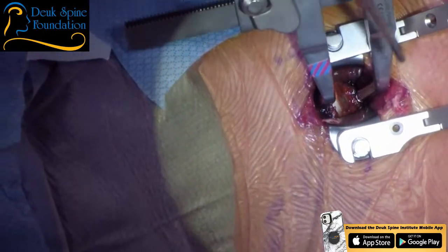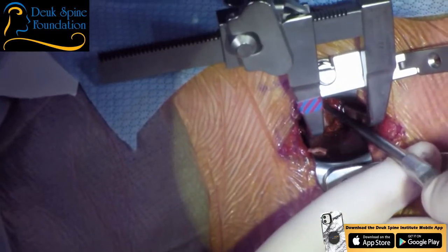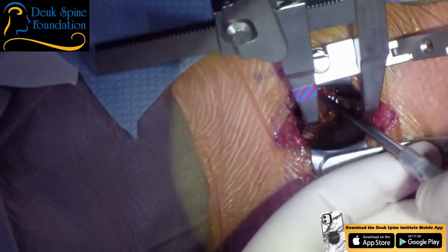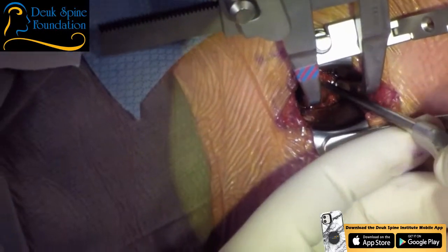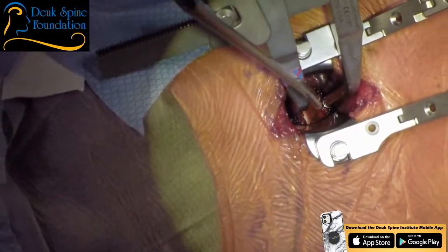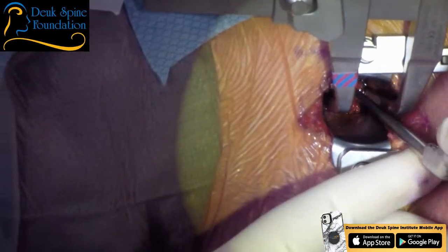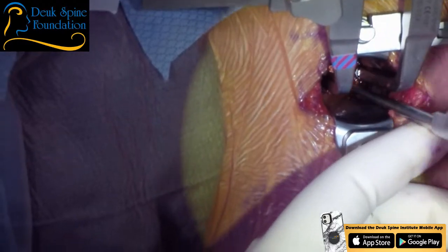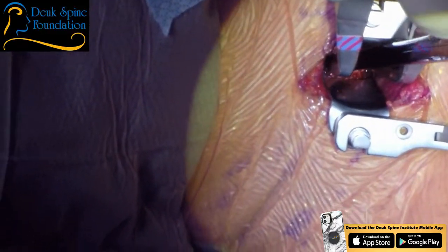Distraction is spreading open of the bones. So we've got really good distraction, and you can clearly see that this disc was injured, traumatic. You can see evidence of inflammation right here. A lot of scar tissue inside the disc, around the annulus. And inflammation usually indicates injury. So this patient has injury and inflammation. The other causes of inflammation are tumors and infections, but I don't see any tumor or infection. This is all trauma related, for sure.